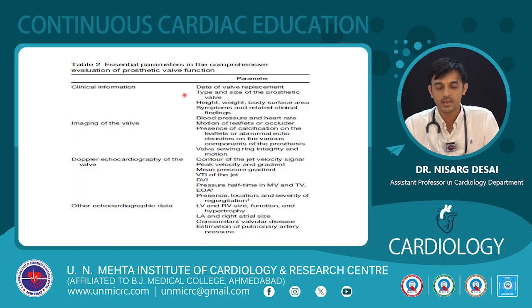We'll study further that if the valve that is implanted has an EOA, or effective orifice area, less than the indexed EOA, that is EOA divided by the body surface area of that individual, then that individual carries a risk of patient prosthetic mismatch, and the complications related to it, which we will study in the next slides.